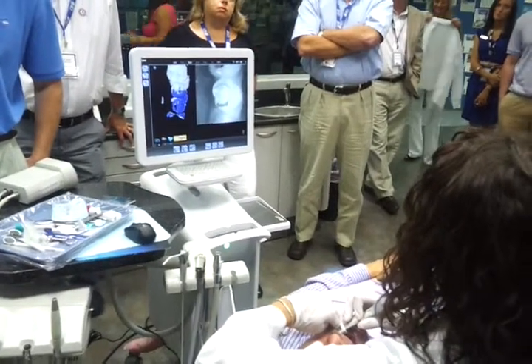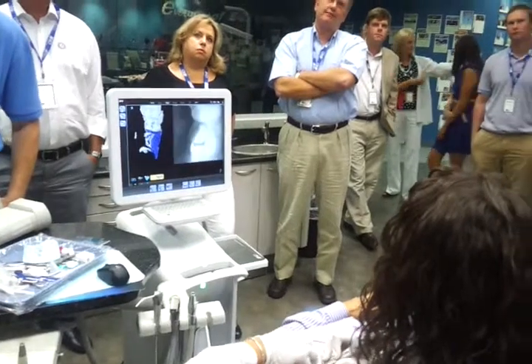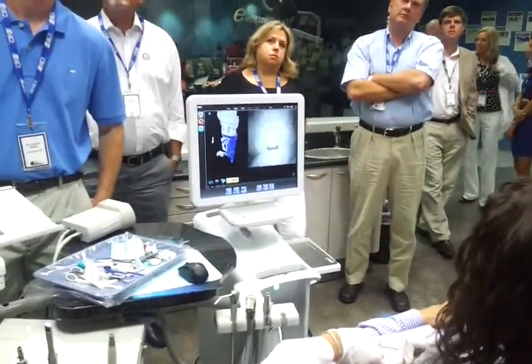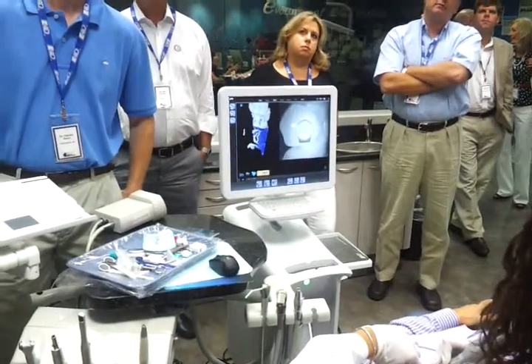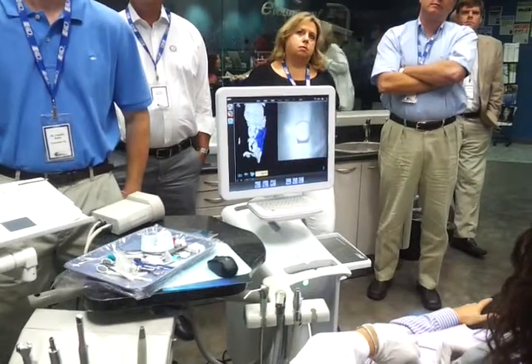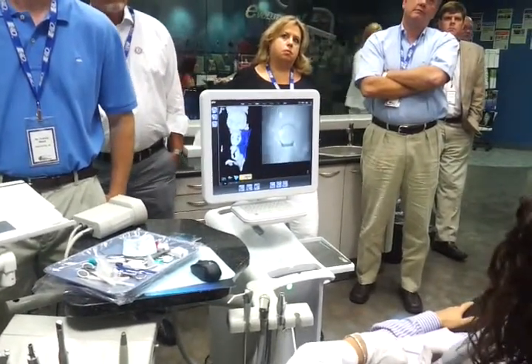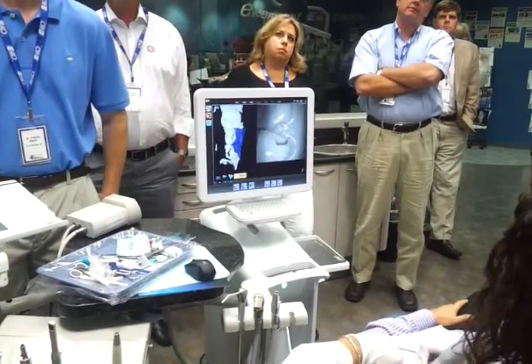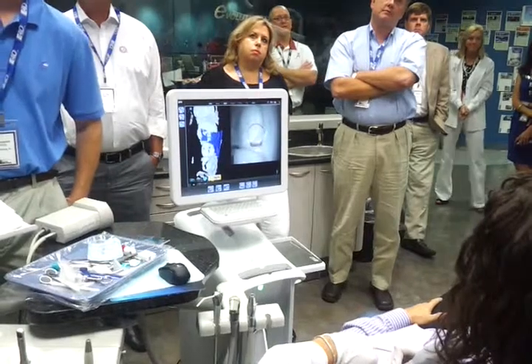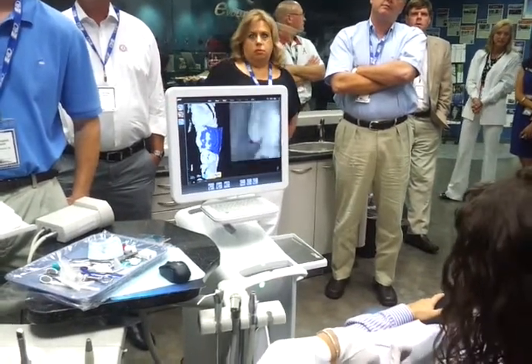So I'm watching the blue build on the left-hand side, and I'm just causing overlap. As I'm starting to run out of real estate, if you could close slightly for me, I just reposition. Now I'm capturing the buckle perspective. Notice every time I stop moving, that's when the system adds a blue scan. That's the new data that I'm capturing. So overlapping, placing my crosshairs exactly where I want to capture that data.